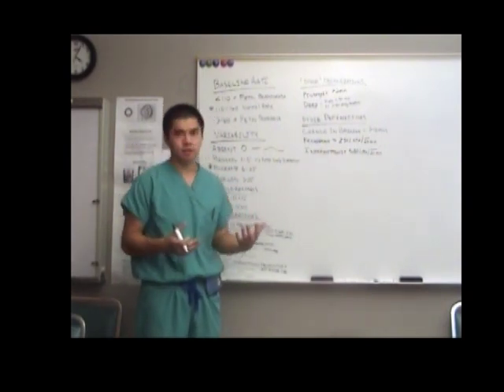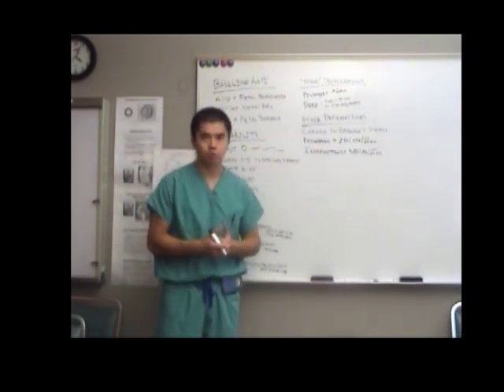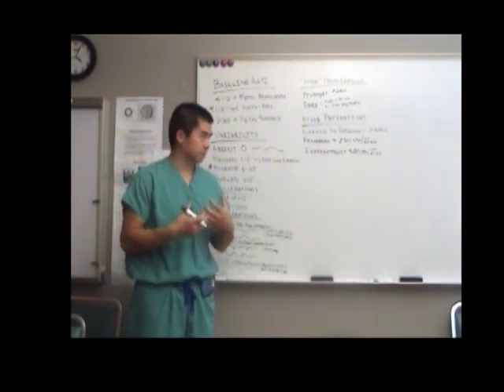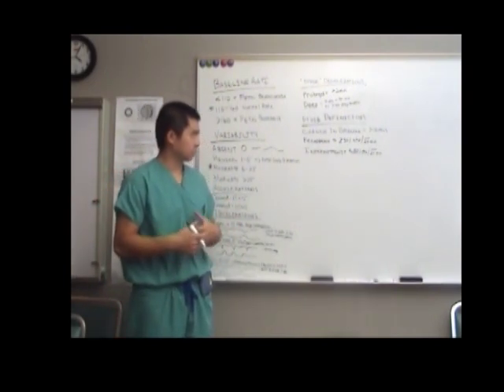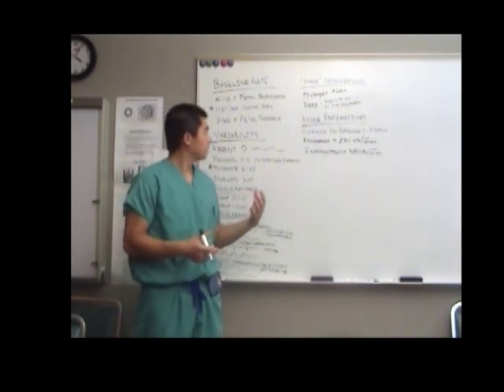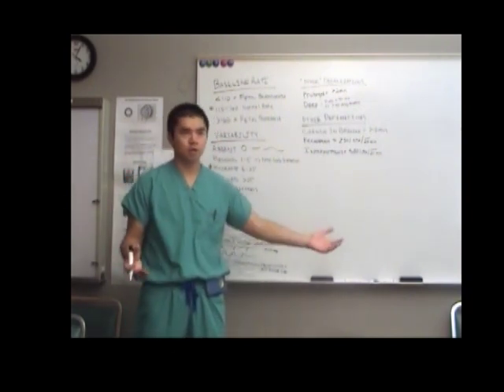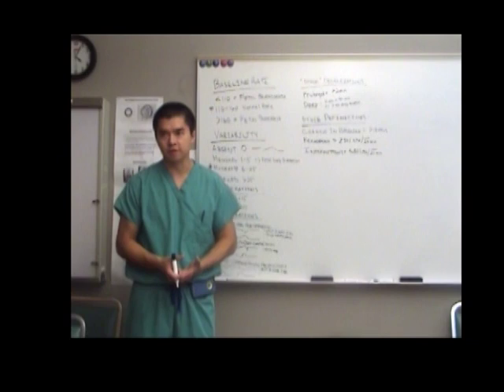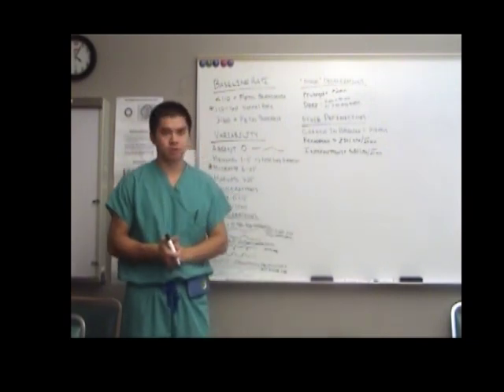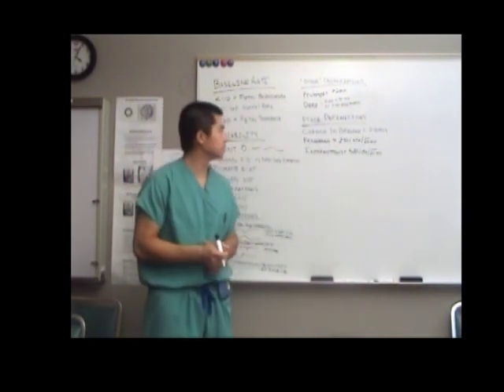And again, you would intervene before you wait that full 20 minutes, even though the definition says it's average over 20 minutes. Just using common sense and logic and managing the patient, you're going to try to step in sooner than later. Now, if you have a deceleration with every contraction over the last 10 minutes, well, you've already met the recurrent definition, because even if they don't have the deceleration with the next contractions over the 10 minutes, you've already had more than half of them have decelerations.